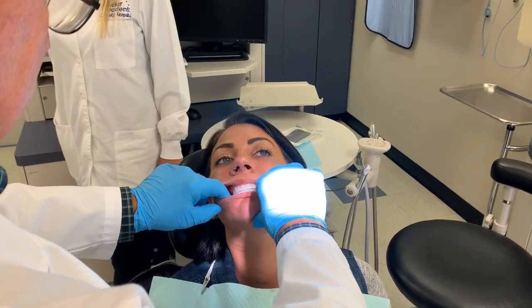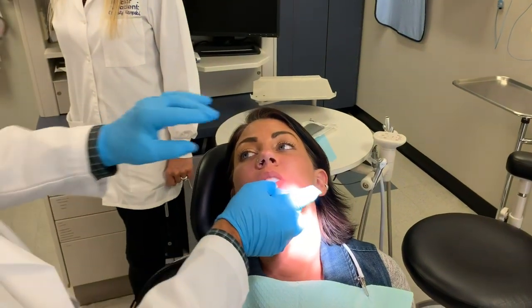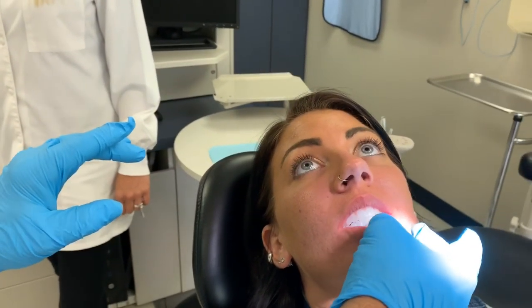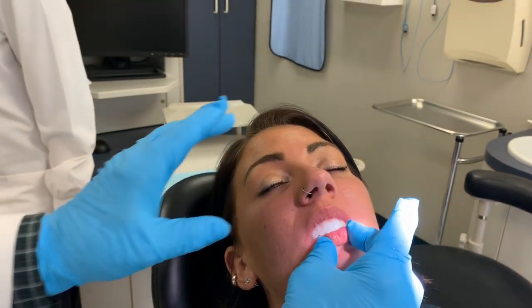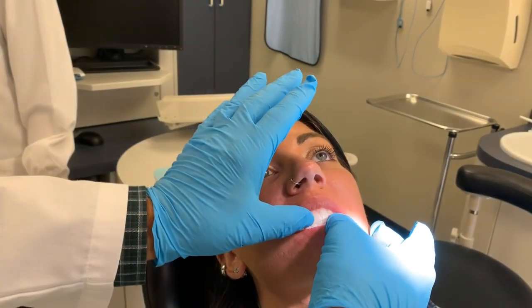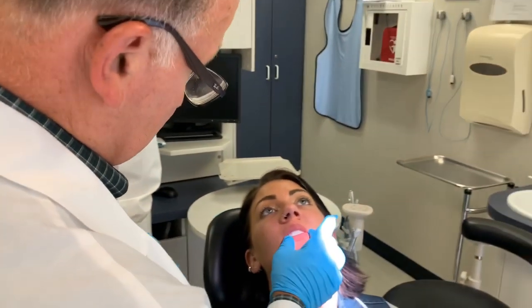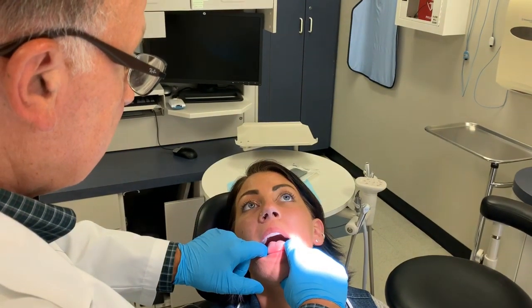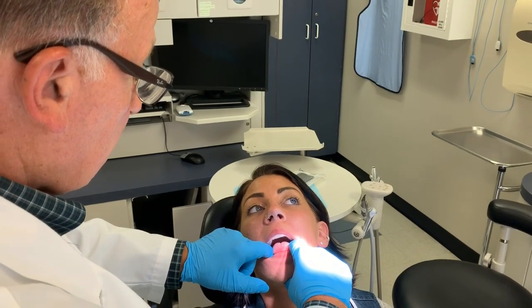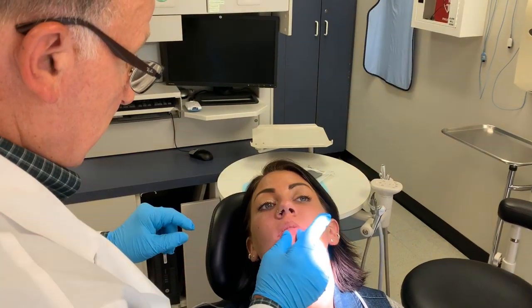Just relax and close down. Dr. Frank points out to the camera the difference in the anterior gap of her teeth comparing the existing denture to the try-in — the overjet is much less on the try-in. They're going to change it a little bit and increase the inclination of the teeth slightly, though not to the extent of where the existing denture teeth were. Open up and stick your tongue out. Relax, close down, and then we'll try again.